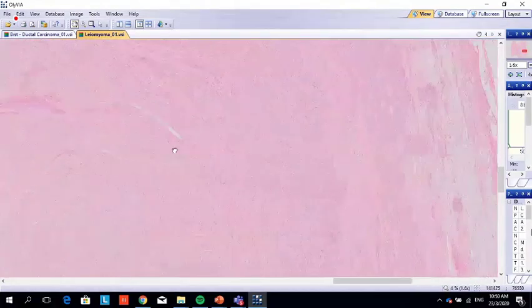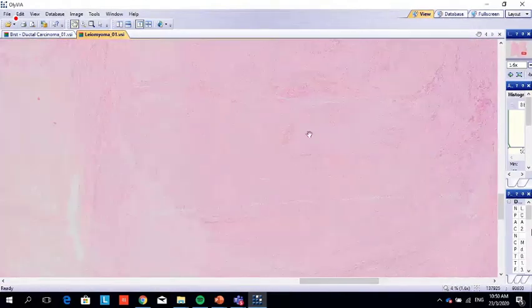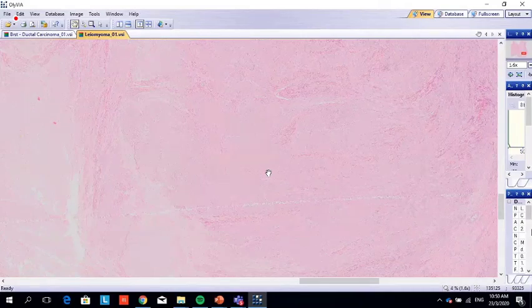That's all in the leiomyoma. The question is what? Look at the gross specimen where we said well circumscribed firm mass with whorly pattern, subserosal, intramural fibroid.